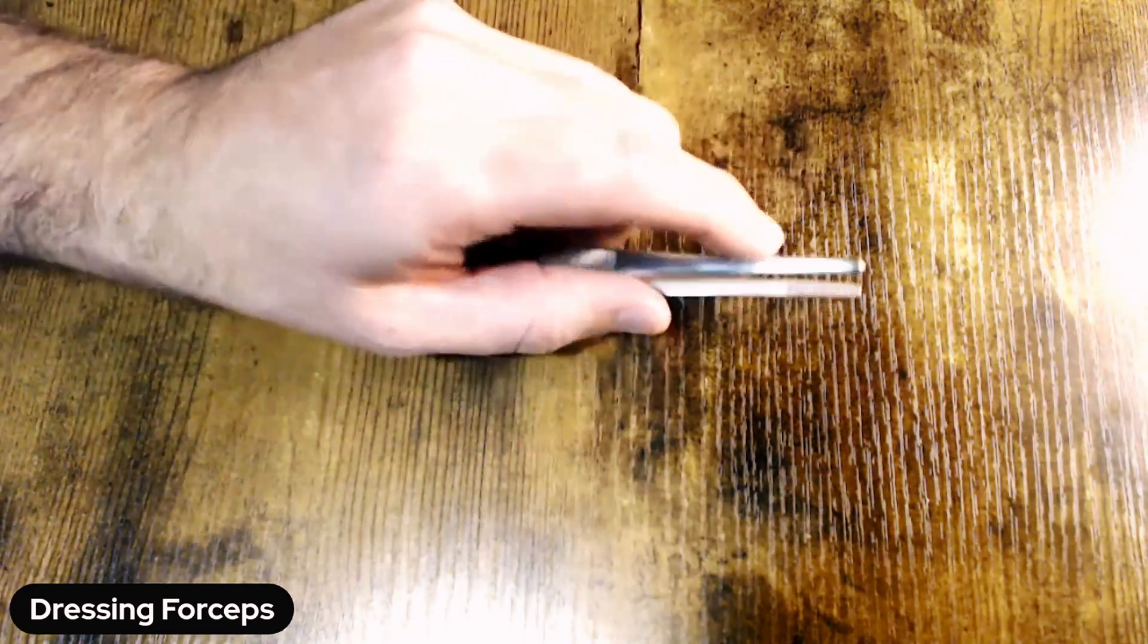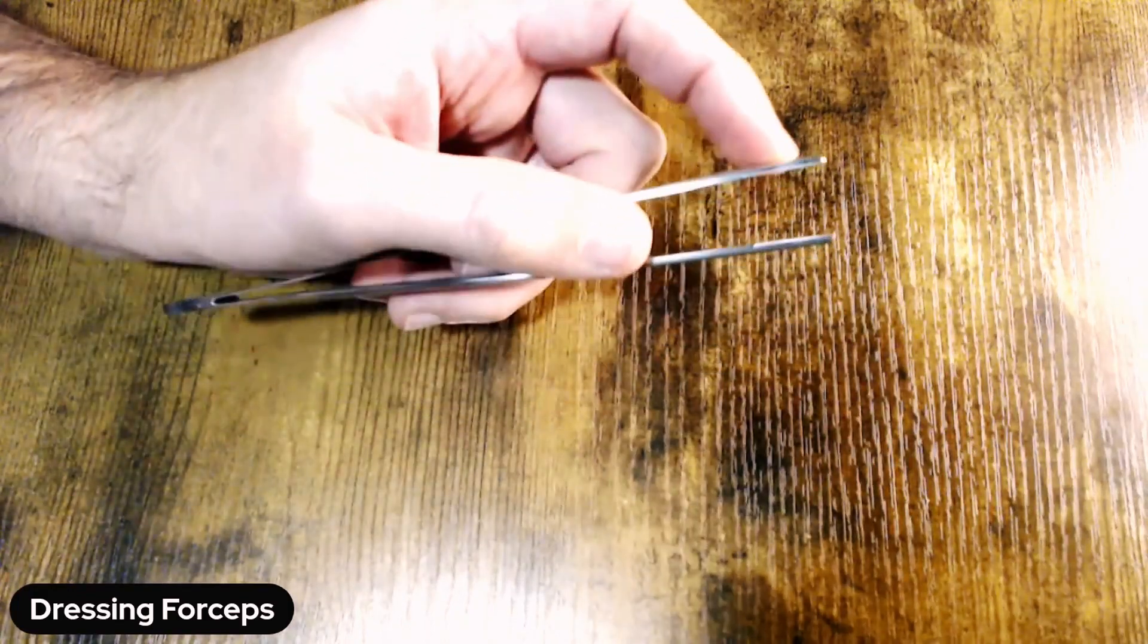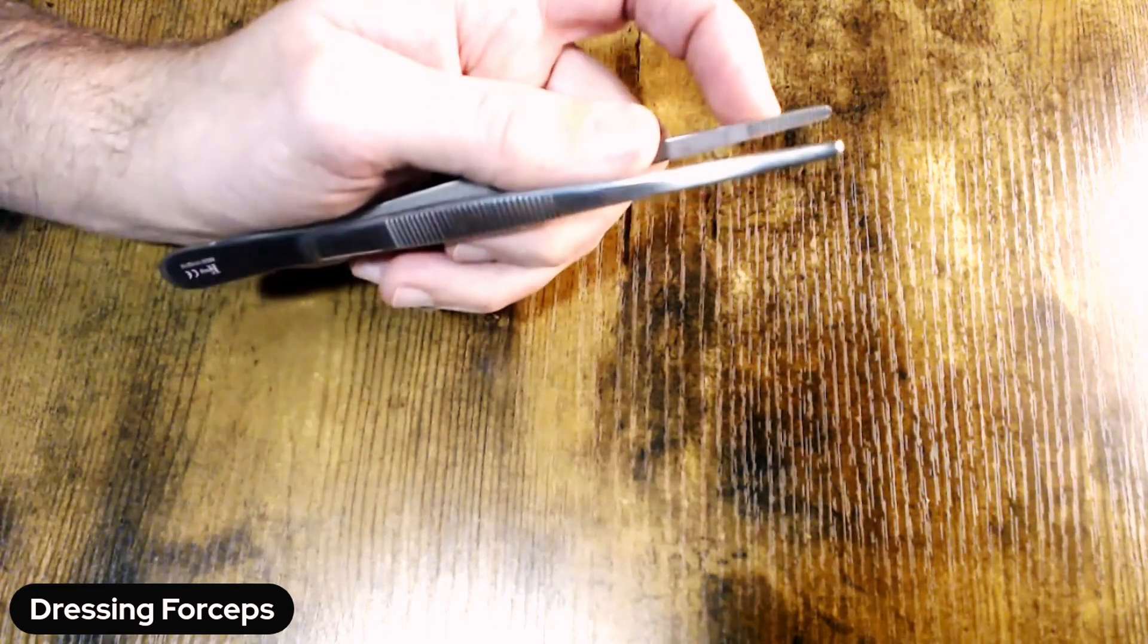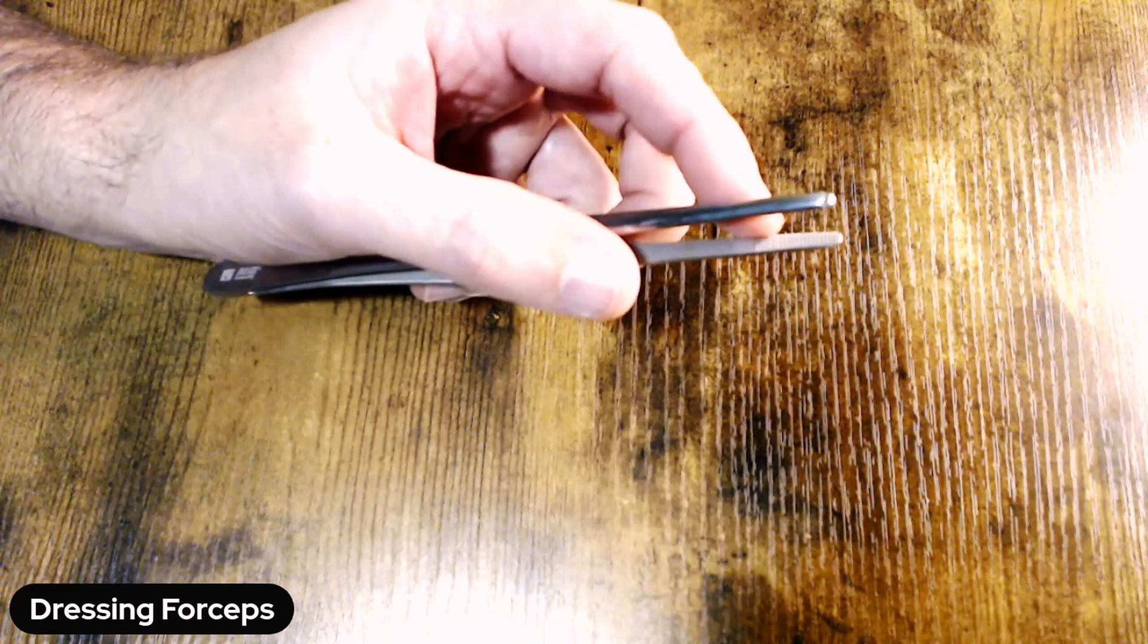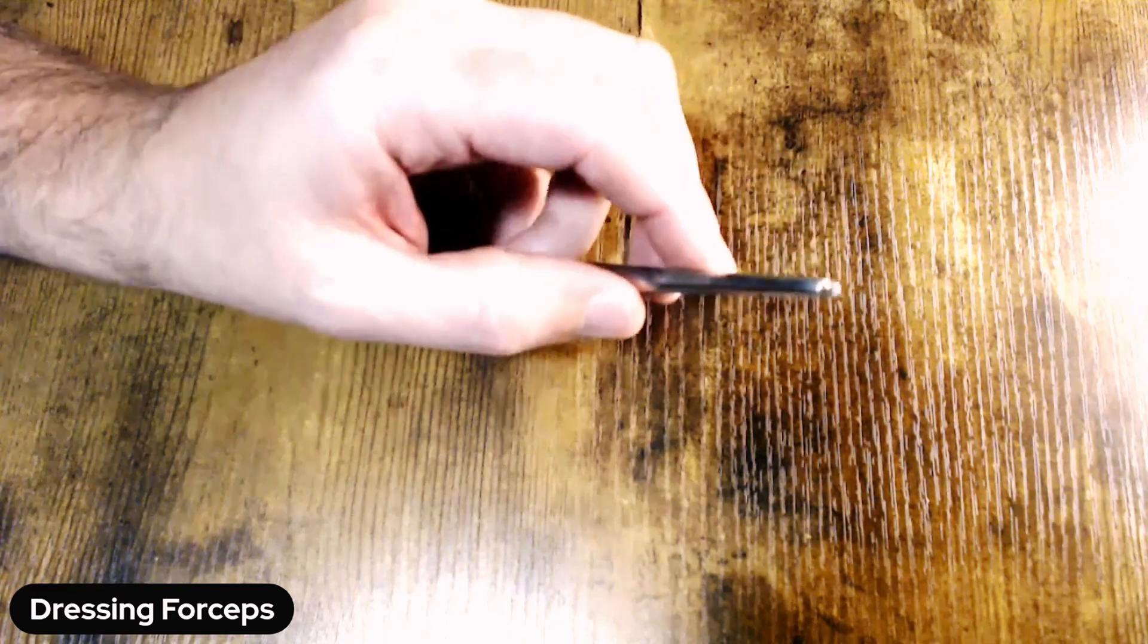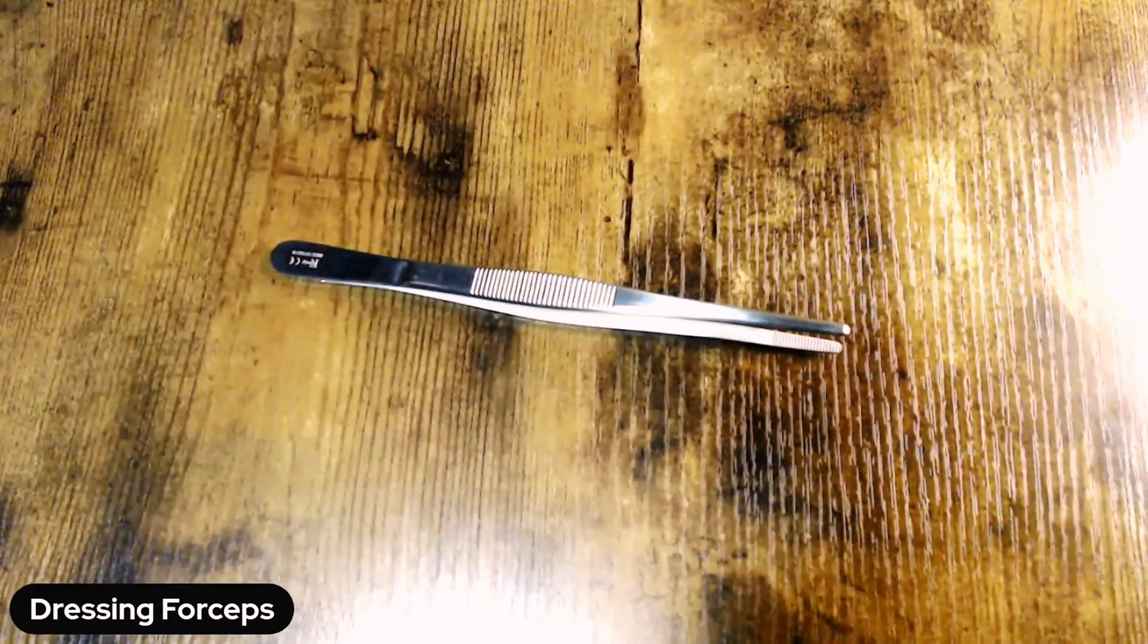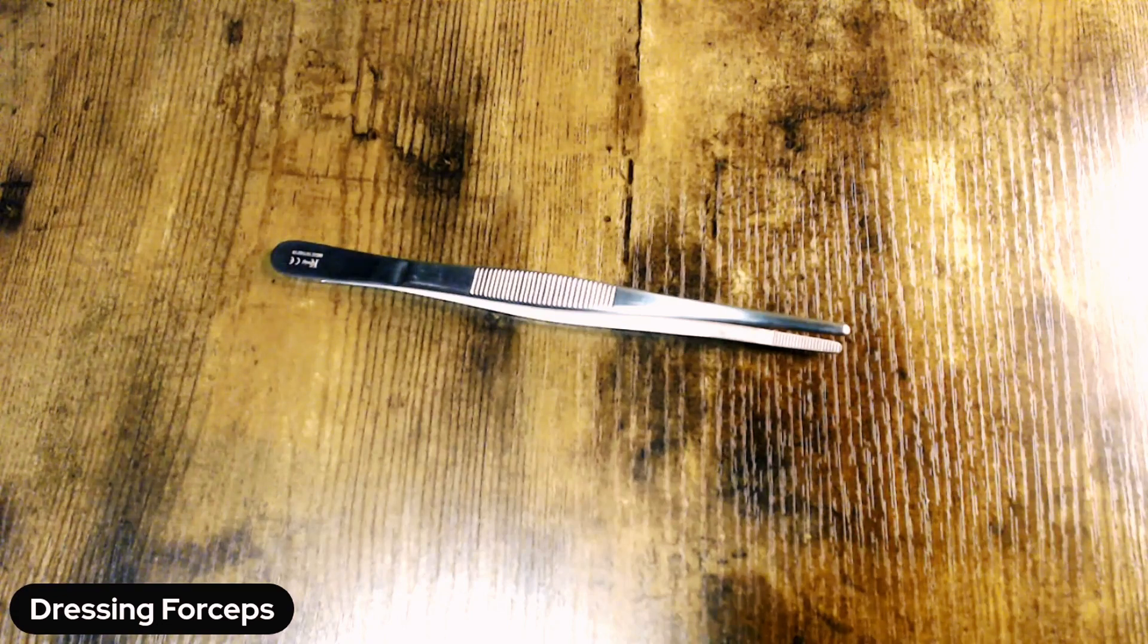Again, the tip-off here, if you're looking closely at the tips, is you want to make sure that there are no teeth on the very end of that distal portion or that there's no teeth or other additions to the side of that jaw of the forceps. So if everything is just a simple serration, most likely you're going to be dealing with a dressing forcep.